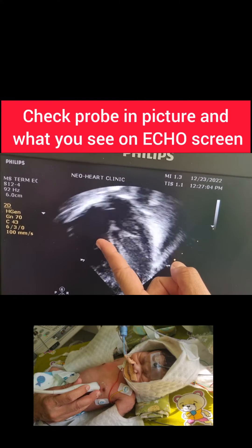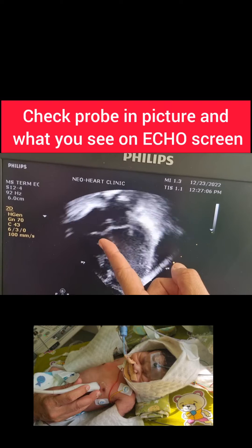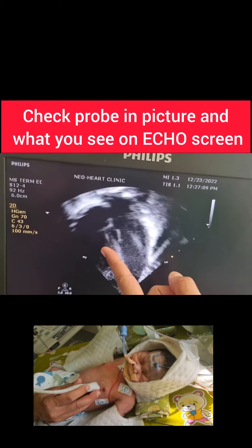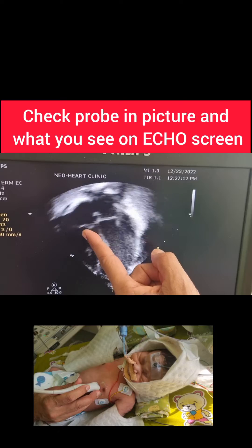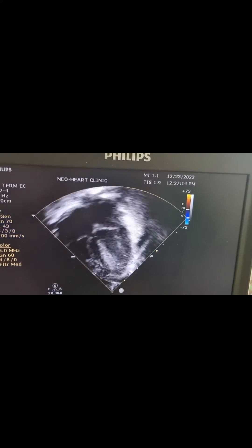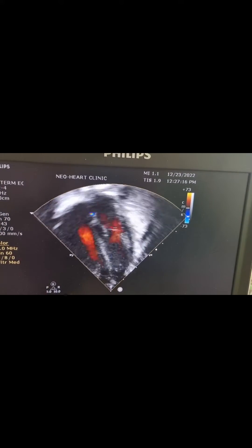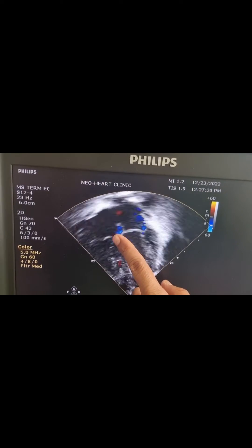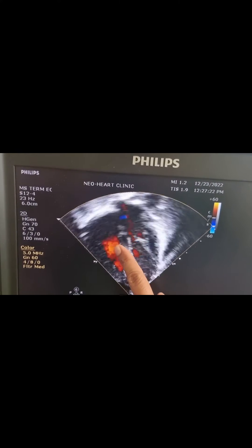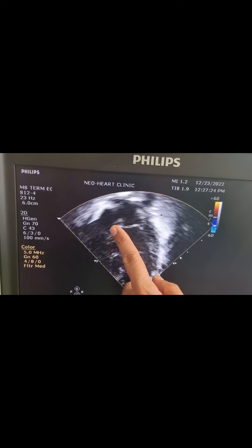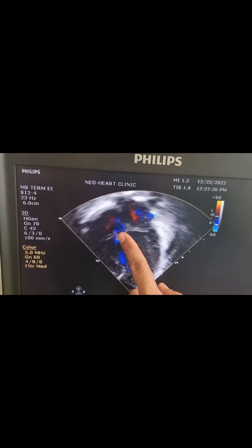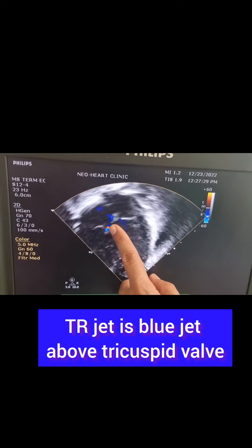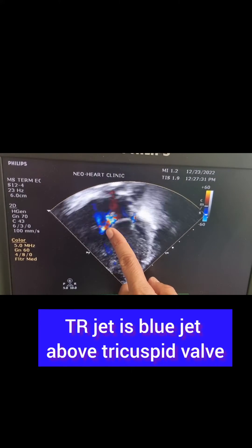If I put a color Doppler, you will start seeing regurgitant flow through the tricuspid valve — that is blood flowing from RV to RA. Seeing this red jet: the red jet is the blood flow from RA to RV. And this blue jet is the TR jet, tricuspid regurgitation — that is from RV to RA through the tricuspid valve.